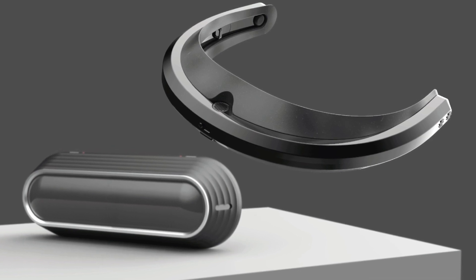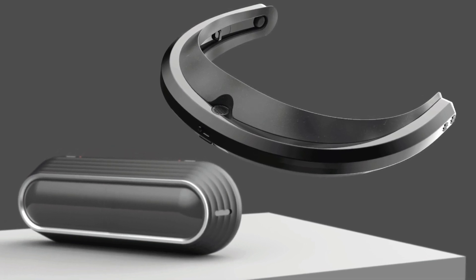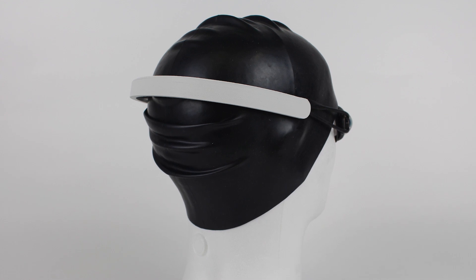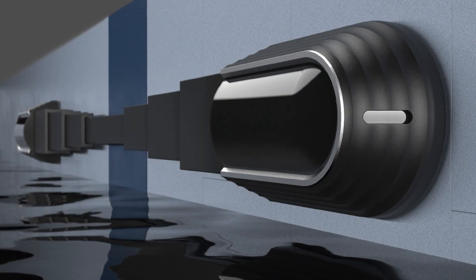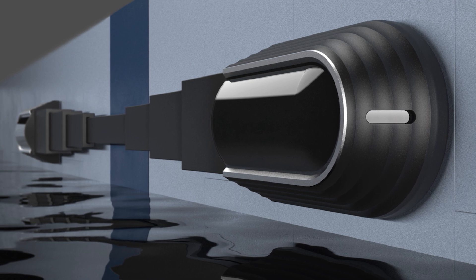OPTIC helps visually impaired swimmers navigate themselves through the water. Currently, they injure themselves quite often either by swimming into the lane rope or by hitting the wall. So OPTIC gives them the information to help them swim in a straight line down the middle of the lane, as well as giving them the information when to turn at the wall and when to touch the wall at the end of their race and during training.